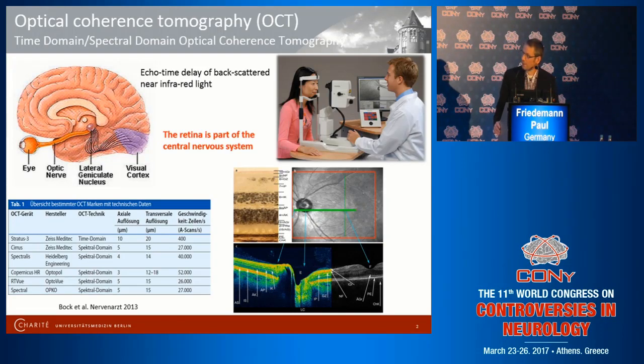The other aspect is an advantage over MRI is that the technical setup for measuring the patient is very easy, very swift. Within a few minutes, you can non-invasively, without dilation of the pupils, acquire these very brilliant images Athena has shown to you in her previous talk.